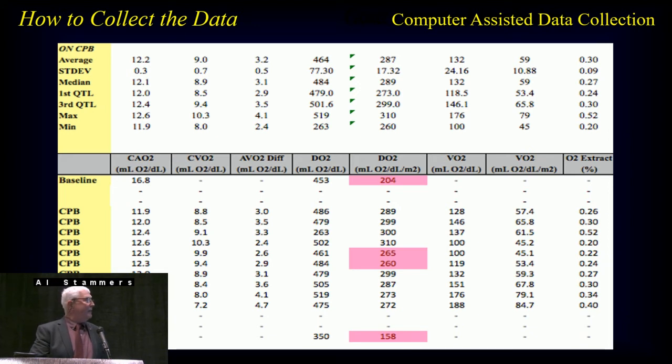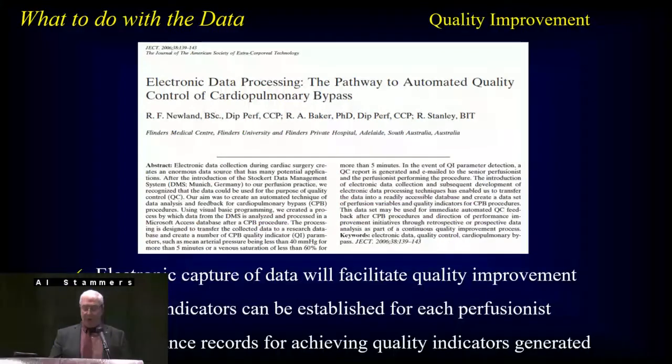hemoglobin, and then after, we focus in on, oh man, for area under the curve for 5 minutes, I had a DO2 less than 270. Well, forget about that. That patient had been living at an area under the curve at a DO2 for perhaps years. So why for 30 minutes it's going to have an outcome is questionable, although it's been shown.